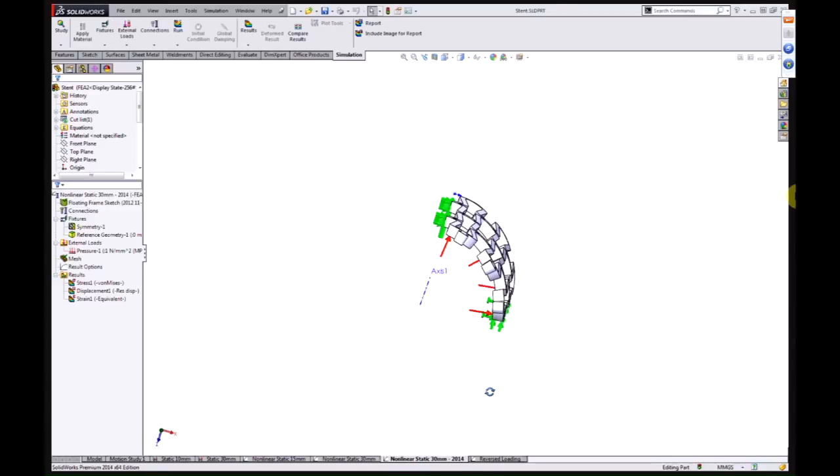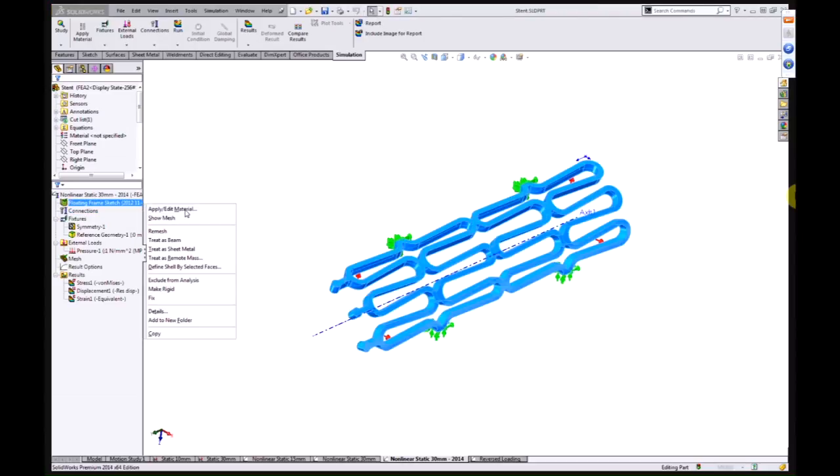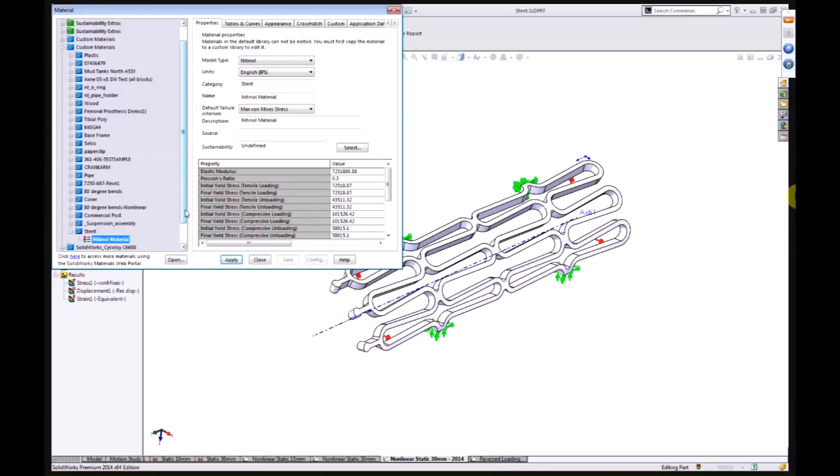So in terms of the material definition here, I've utilized a nitinol material model that's part of SOLIDWORKS Simulation Premium. And if you look at a stress-strain curve for a material called nitinol, it looks absolutely nothing like you'd expect for a classic stress-strain curve for a plastic or for a steel or aluminum or that sort of thing. There's a reference in the SOLIDWORKS help file here, which is basically showing some typical loading and unloading curves for a particular grade of nitinol.